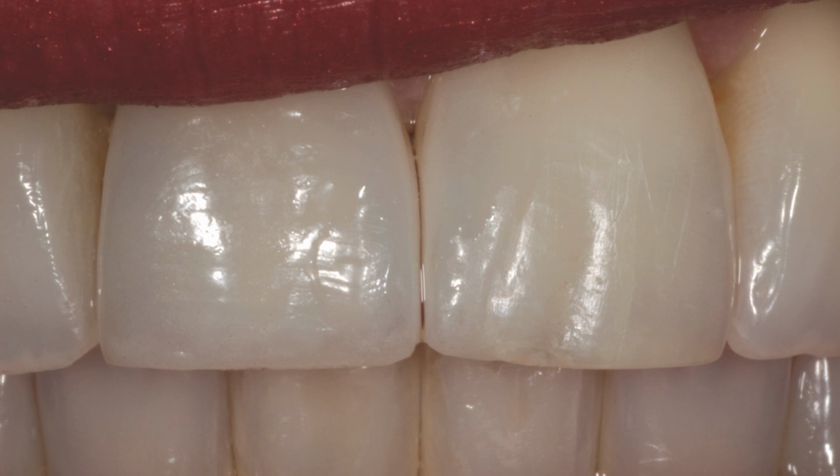The smile view shows that the gum tissue now has filled the gap between the central incisors. Also note that the width of these teeth are the same and the partial veneer's edge is not apparent.